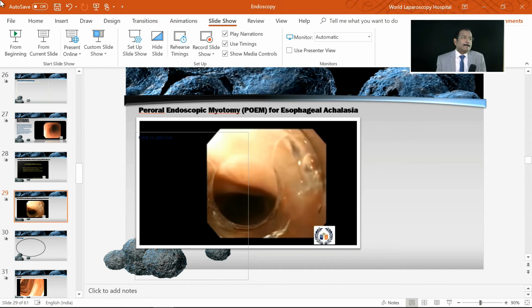Yes. You said we should check the leak before going to the procedure. How is it done? Do you know what happened? You have to take the tip of the endoscope in a water glass bottle, and then press the irrigation. You will see bubbles coming out, and then press it more. Then you will see fluid coming out, and at that time you should check the leak outside. Sometimes the bottle is not connected tightly, and all the fluid is leaking from there. Just like when we do suction irrigation, then sometimes it leaks from outside.